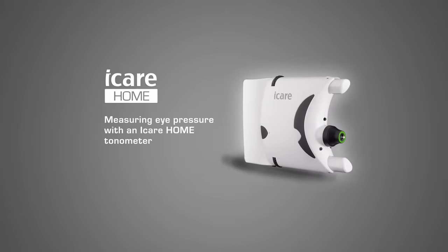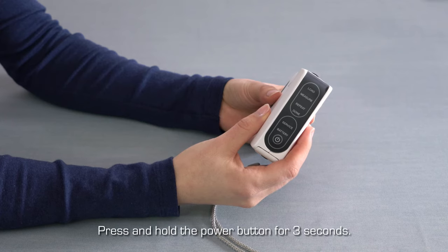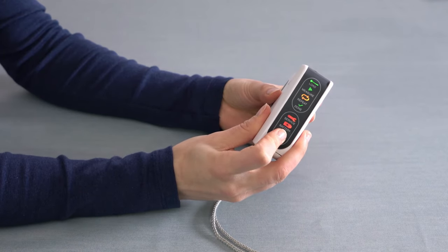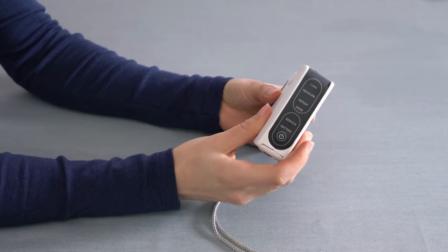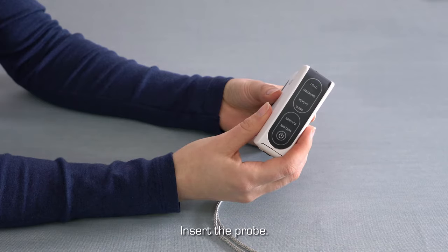Measuring eye pressure with an eye care home tonometer. To power up your eye care home tonometer, press and hold down the power button for three seconds. All the display panel lights will flash once and you will hear a beep. When the load indicator is flashing green, a measurement probe can be inserted.